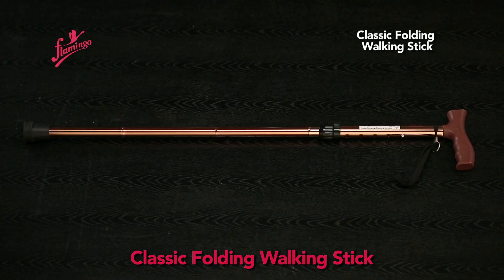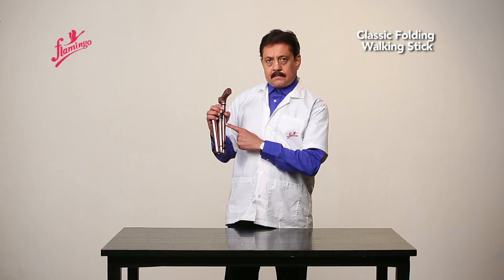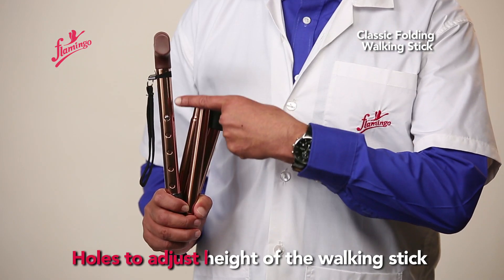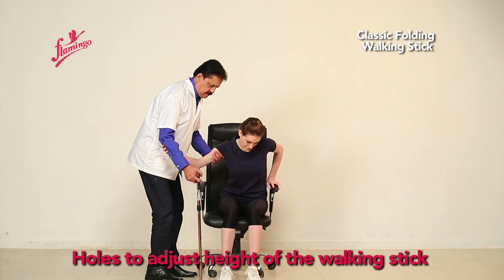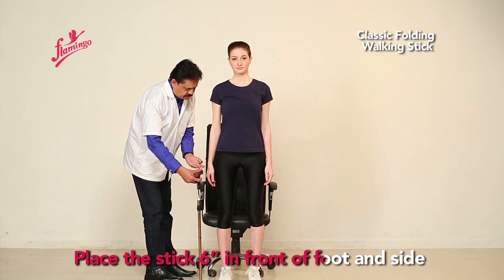Classic Folding Walking Stick, available in universal size. It has holes to adjust the height of the walking stick. Place the stick 6 inches in front of the foot and to the side.